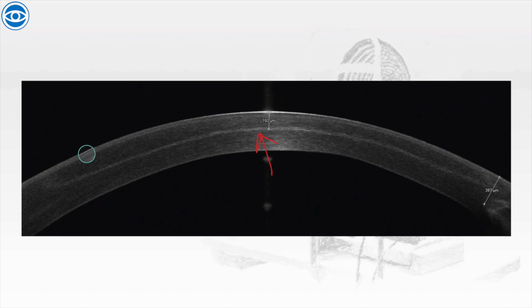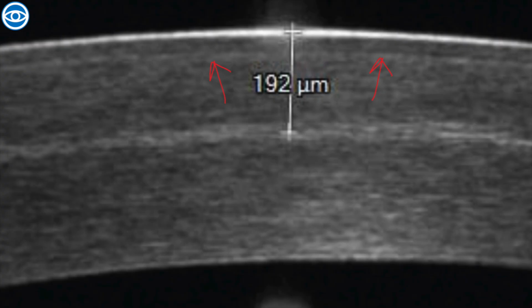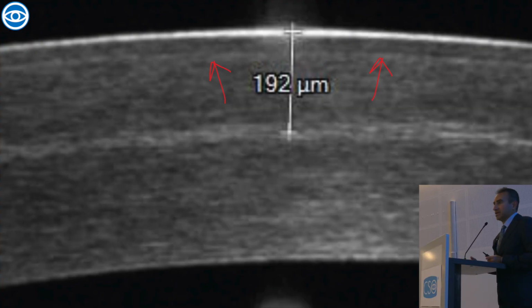So you can tell, even though the patient doesn't know. Often the patient comes to me, and this was actually one of the reviewers in GRS when we submitted. He said, why would you need the algorithm? Patient would tell you the history. Often the patient tells me the wrong history. They tell me I had PRK and they had LASIK, or vice versa. Or if they had cross-linking, they didn't know they had PRK, and so on and so forth. You'll be amazed.